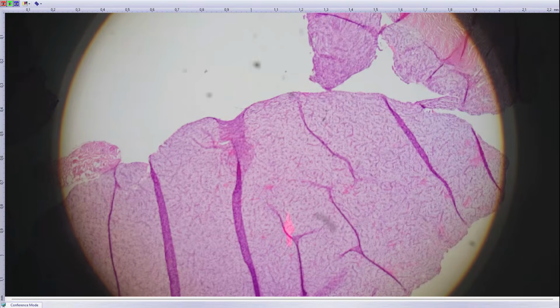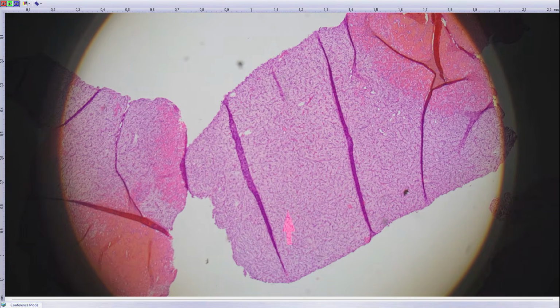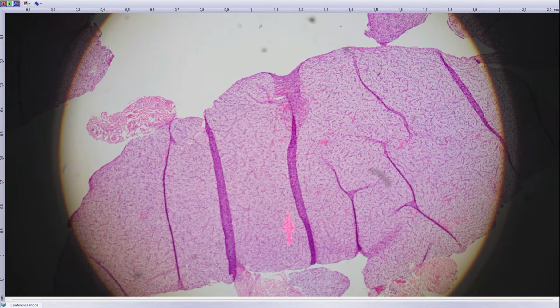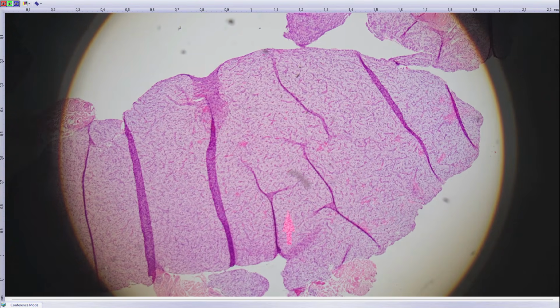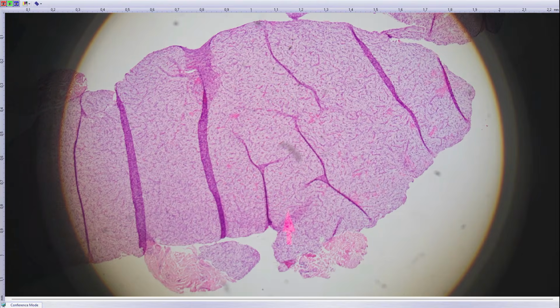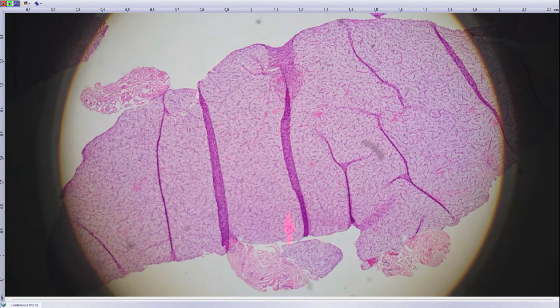And the only way to confirm this diagnosis, if you think the morphology is not sufficient, is either one new antibody, which we don't have, I don't even remember how it's called, CYP something, or you can do molecular genetics, because these tumors typically have either NCOA2 or NCOA3 gene fusions with the AHRR gene as fusion partner. We did molecular, and there was indeed an AHRR-NCOA3 gene fusion, which is the rare fusion type. So this is soft tissue angiofibroma.